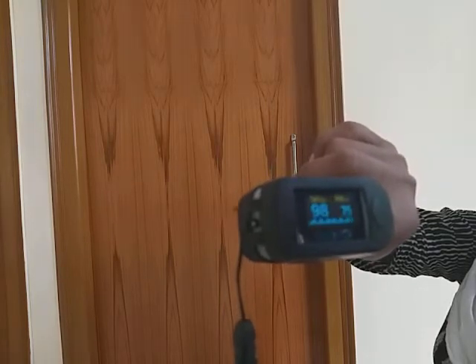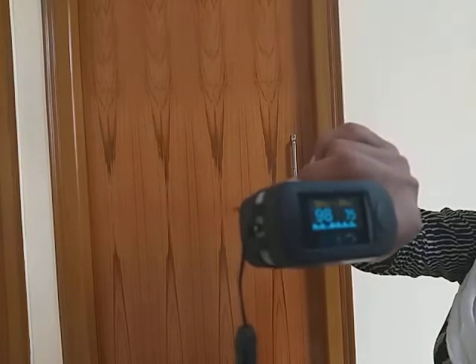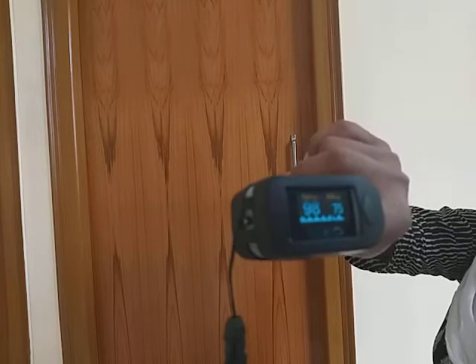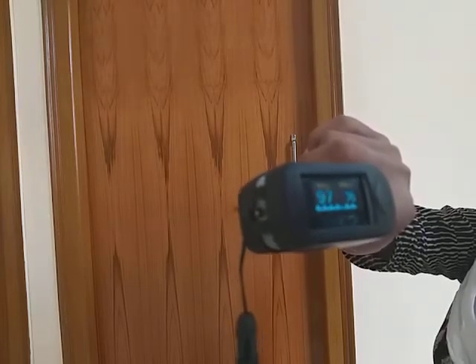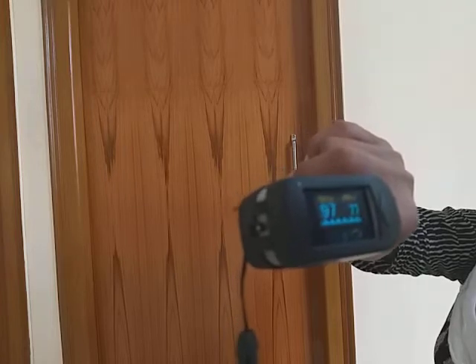By now, 10 seconds has already elapsed. Her pulse rate has come down to 77 and saturation is 98%, so there is hardly any dip. We continue tracking pulse rate and saturation every 10 seconds for two minutes. At 20 seconds, the saturation has come down to 97% and the pulse rate is 75 per minute.